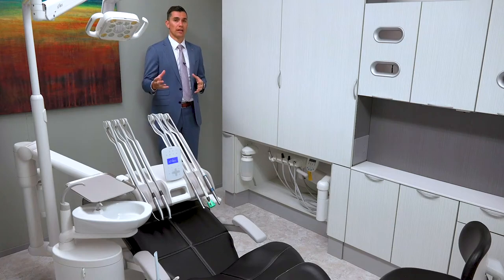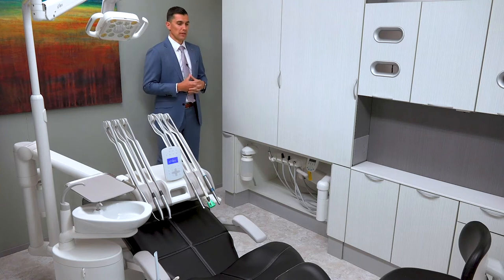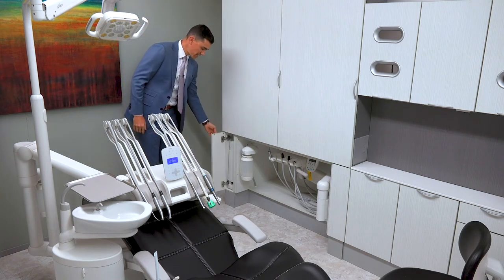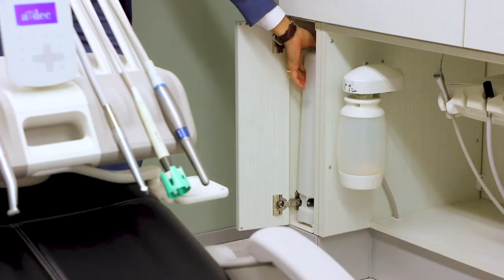We're going to focus on our ICV — our integrated vacuum line cleaning solution that we put into our cabinetry. In our operatory today, we have a full-size central, and at the end of our full-size central, we actually have our tank stored at the bottom here.